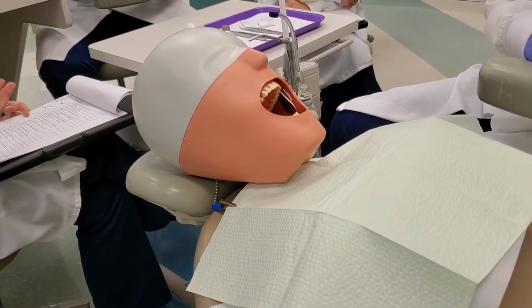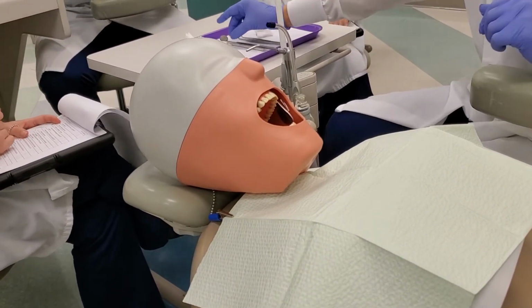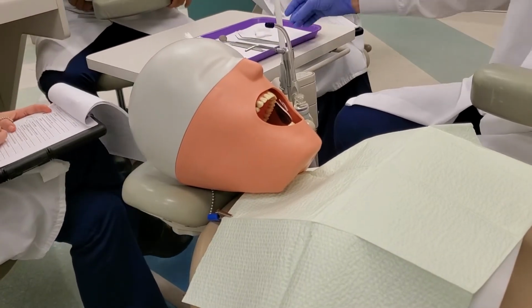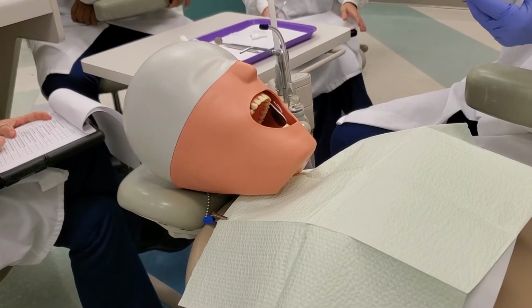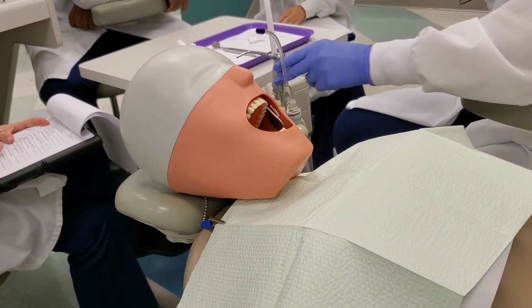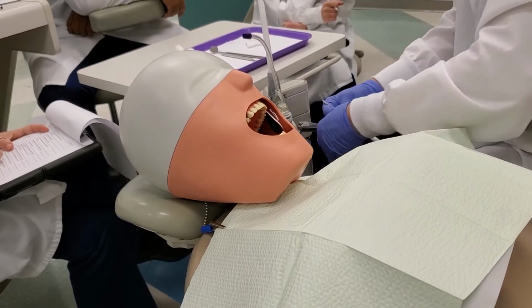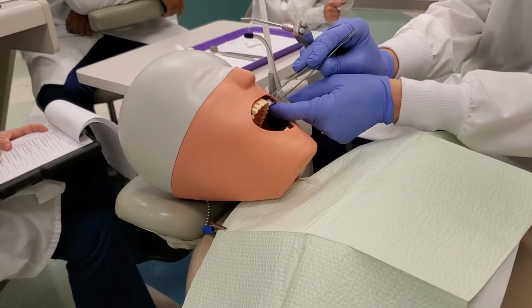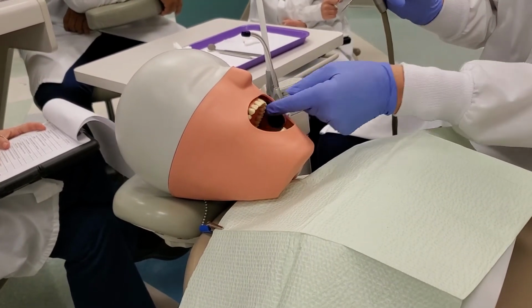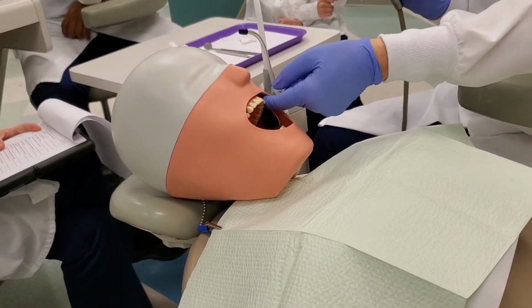Position the cotton rolls for the maxillary left posterior. So you can use cotton pliers if you want, or you can use your fingers. I don't care. But again, what makes it easy, you can use your finger if you want to retract, and then pull it up there. And hopefully it'll stay up there. Another thing that'll fall down too. But anyways, you're going to just place it on up there, okay?